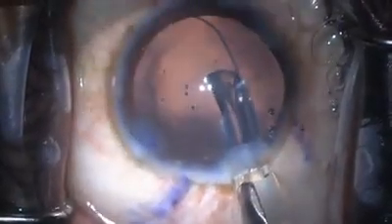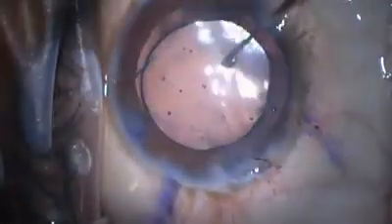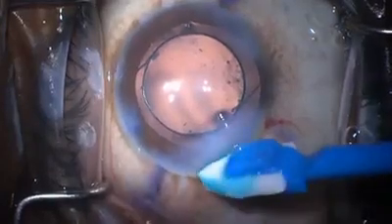So here we're going to place this 3-piece MA50 lens into the sulcus initially, with both haptics placed in the sulcus. And now we're going to prolapse the optic posteriorly so that it's captured by the anterior capsule. And this is an extremely stable configuration, both for long-term prevention of phimosis and short-term to have the haptics and the capsular tension ring. Patient's done well so far.